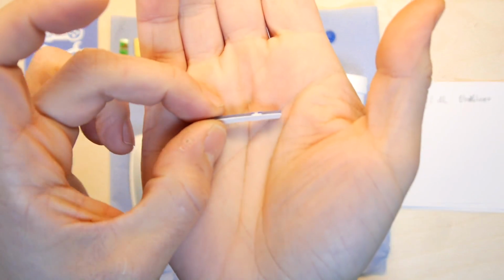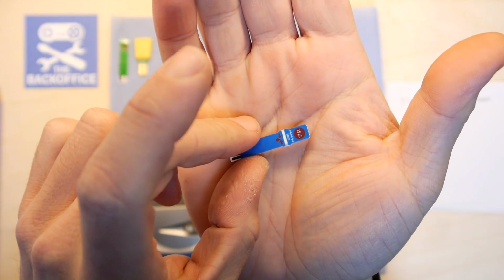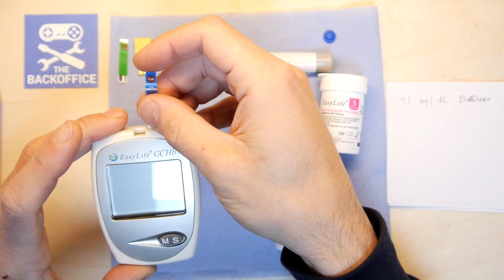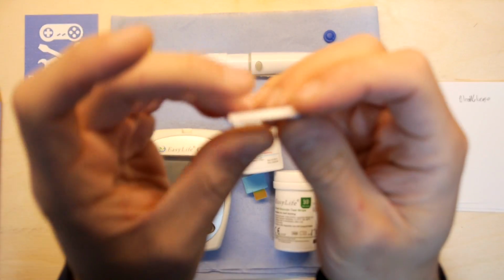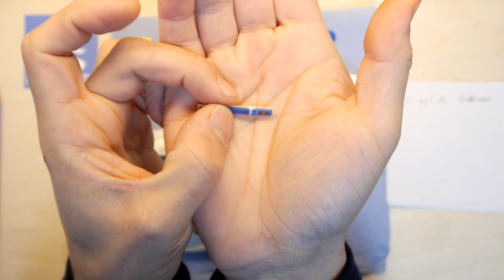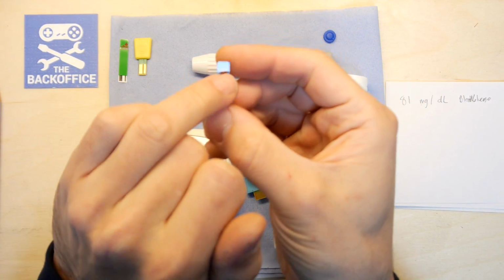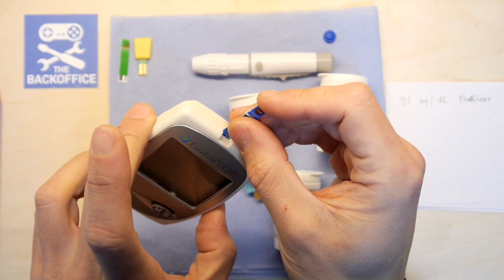Packed with all the technology. Look at that. So that is a complicated test, so I'm going to make sure we take a bit of time over this bad boy. You can see that the chamber as well is massive. That chamber that you're going to have to try to fill via the capillary action is looking for a lot of blood. So it's going to take some effort, and you can see that circle is showing you how big a blob you want of the second go too.